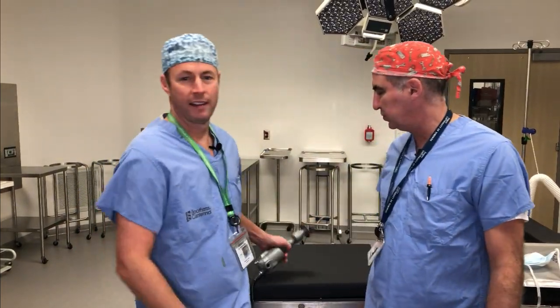People who have a cast on and it's time to get the cast off or get it changed — a lot of people are anxious about how is this cast going to get cut off. Is it going to cut my skin? Is it going to hurt? They hear the word saw and they think it's scary. So show us what a saw is.